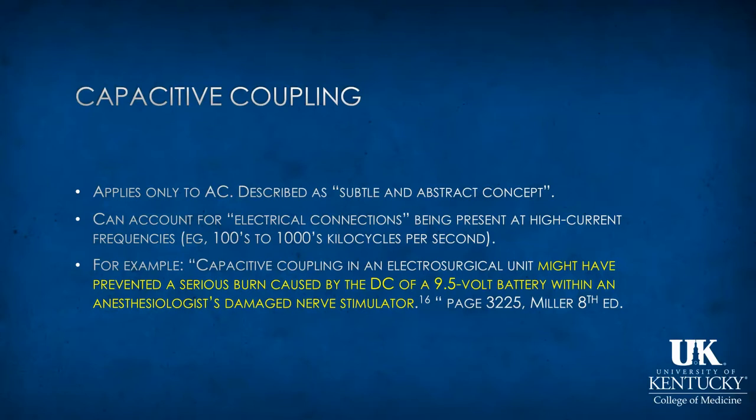So, to summarize, old equipment or malfunctioning equipment combined with some of our monitors, or perhaps the presence of metal in patients' bodies, such as tongue rings and ear rings. Although at first it would seem to be unlikely to cause a burn, apparently capacitive coupling is the explanation for some of these burns that have occurred in patients.